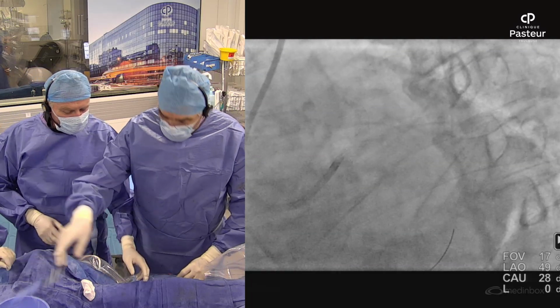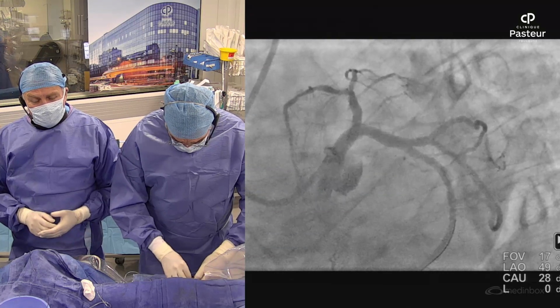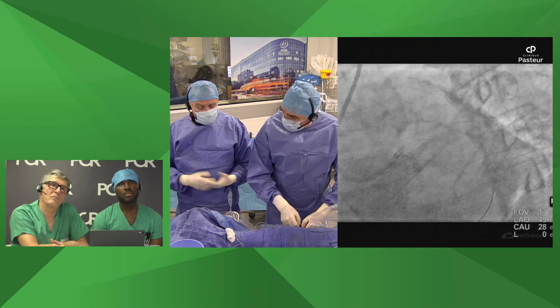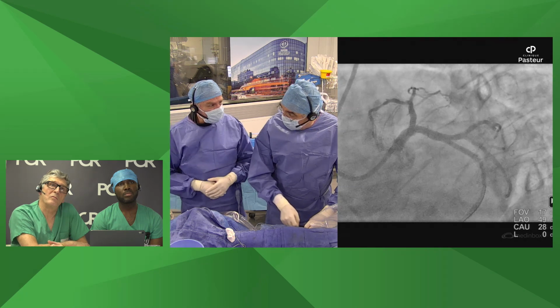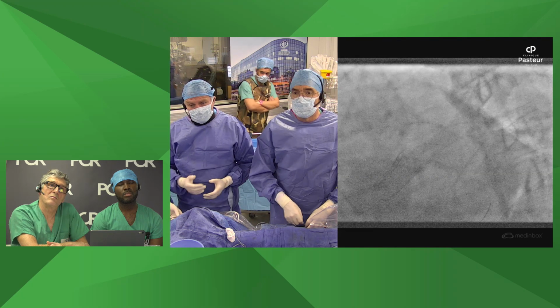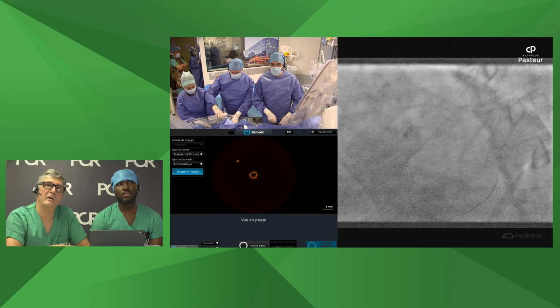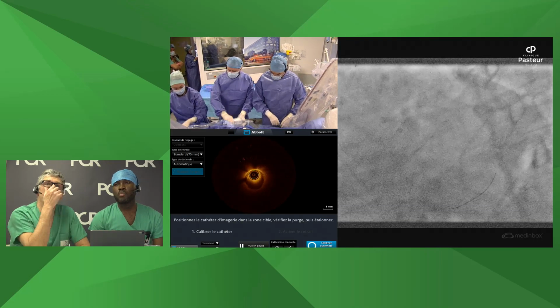Regarding the initial question of Thierry about when we use intracoronary imaging: in our cath lab we are using it very rarely, probably only at the final angio when we have any doubt about the result. I don't remember having used it before starting the procedure, because our strategy is already decided. At the end, not systematically, and only if we have any doubt about the quality of the angiographic result. I fully agree with you. We are doing exactly the same in my lab. So will you use OFDI or OCT?